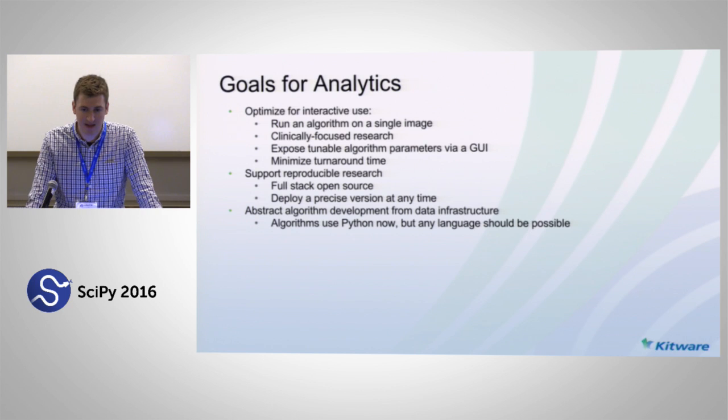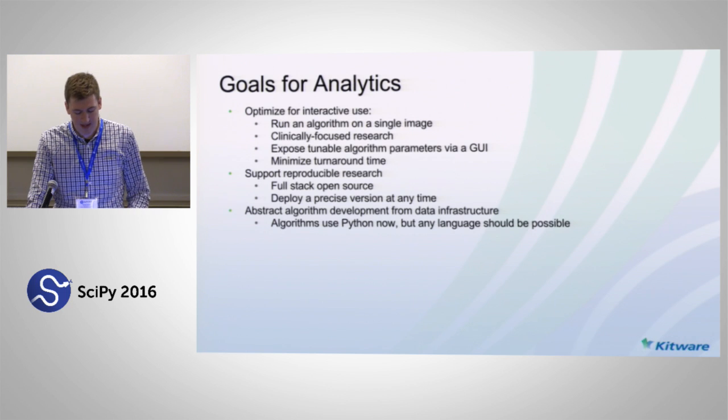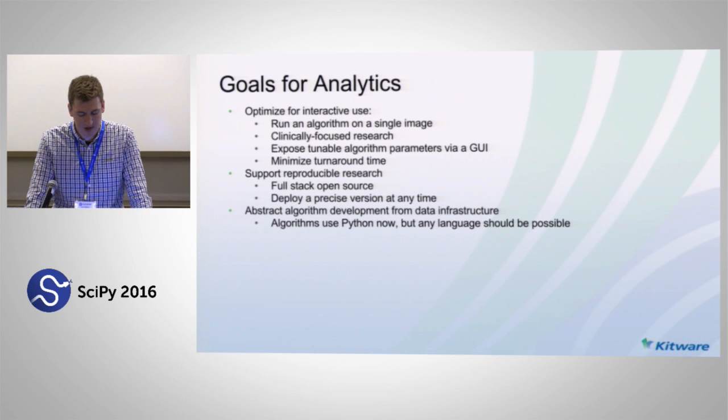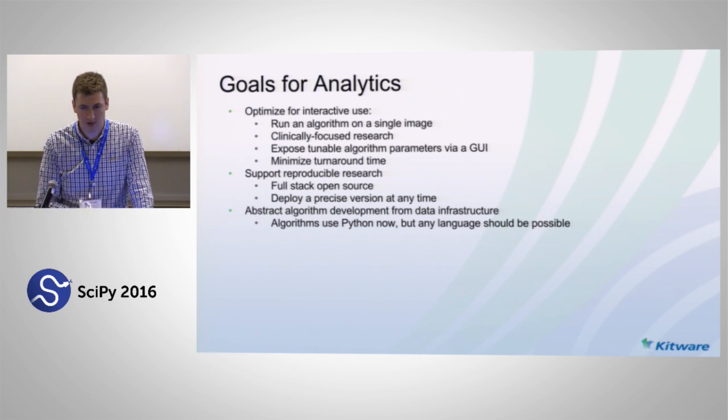And in many cases, this may then turn into a machine learning problem afterwards. In our case, we're focused more around viewing individual images because this is what ultimately allows us to work most closely with clinicians, who only understand individual images. If you give them aggregate statistics about extracted features, you can draw conclusions, but you can't actually see the clinical correlation between this physical feature in an image and this number of an algorithm.